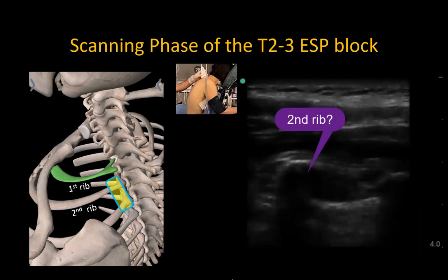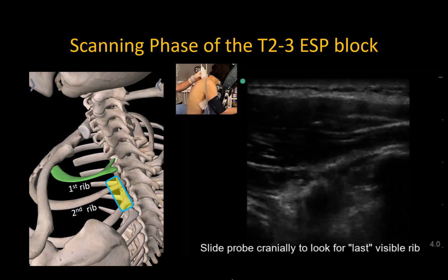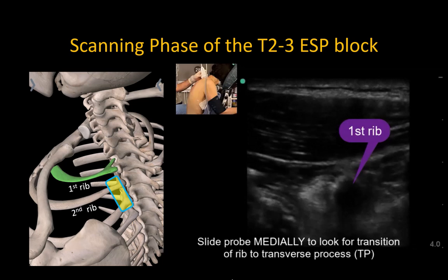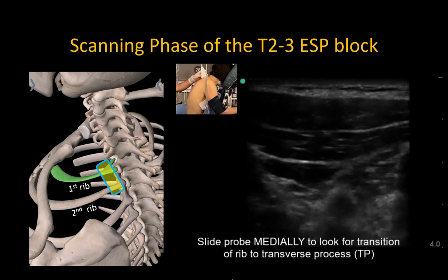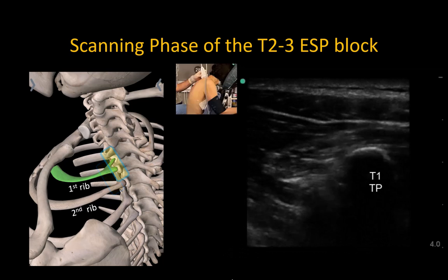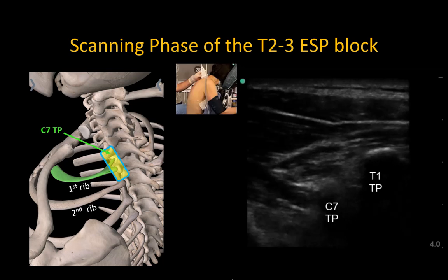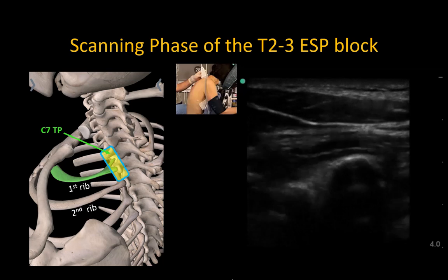To ensure we're targeting the right level, we can start with the probe in the parasagittal orientation, 2-3 cm lateral to the midline and high up on the trapezius muscle, which usually places the probe approximately over the second rib. Slide the probe cranially to identify the uppermost visible rib, which should be the posterior section of the first rib. Then slide medially to visualize the transition to the T1 transverse process. The C7 transverse process will be seen as a slimmer, hypoechoic dropout shadow, confirming the identity of the T1 transverse process.